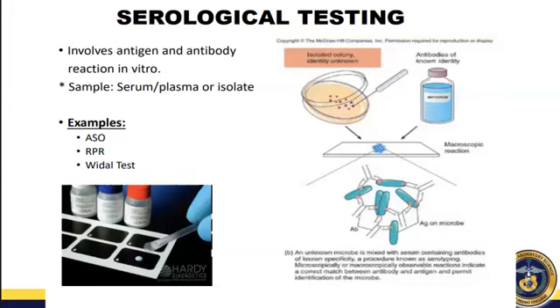Okay? So, pero ngayon, yung Widal, kasi parang napakatagal na niya, no? Napakatanda na serological testing. Yan natin mas mga bagong technique, no? Like the Typhi-dot method, na lateral flow method na lang. Parang yung mga pregnancy test na lang, isang drop-drop na lang ng serum. Tapos, i-observe mo na lang kung may linya. Okay? So, again, very useful ang serological testing and microbiology.